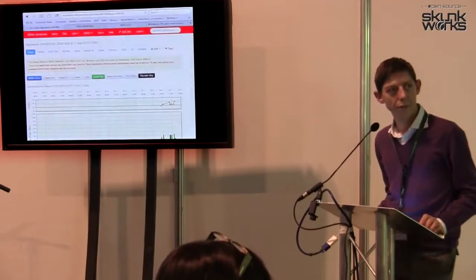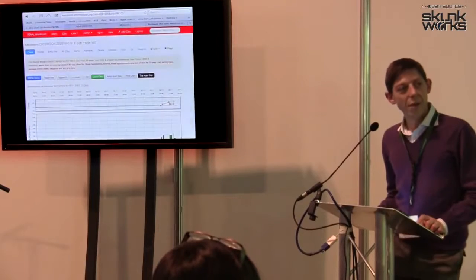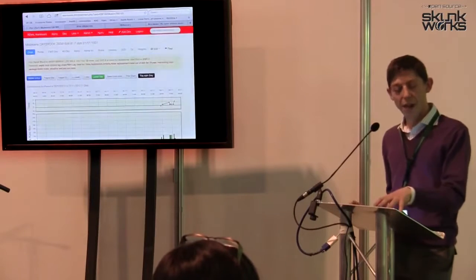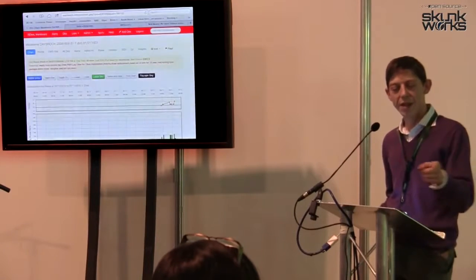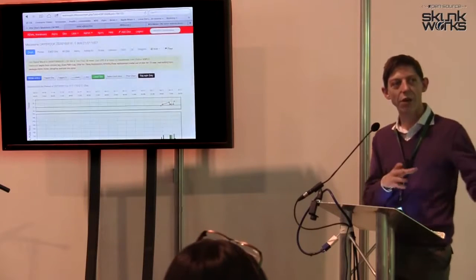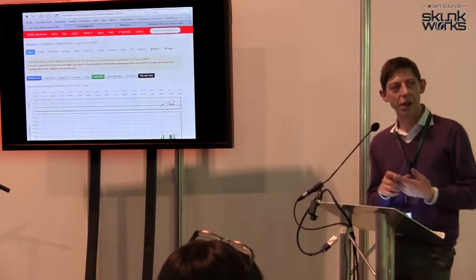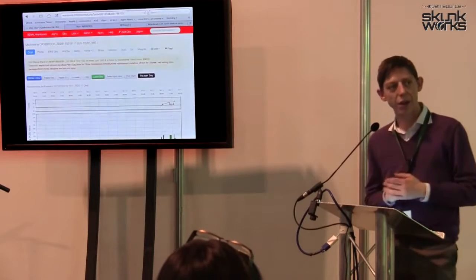If the wireless goes down, how would you take observations? Well, this is one of the things that we've been working on with King's and with Luton, to have some sort of business continuity plan. So one of the things we do, if the wireless network has gone down or if the EPR is down for some reason, then we have a system whereby a paper version can be created quite quickly, showing all the last observations for a patient, and that can be printed out. Most trusts that we've been working with have a PC and a printer on a UPS, and they just print out the charts, they put them around the beds, and they can carry on capturing the obs.